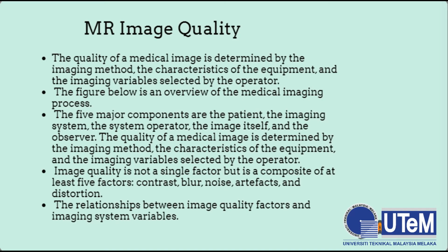Image quality is not a single factor but a composite of at least five factors: contrast, blur, noise, artifacts, and distortion. The relationship between image quality factors and imaging system variables.